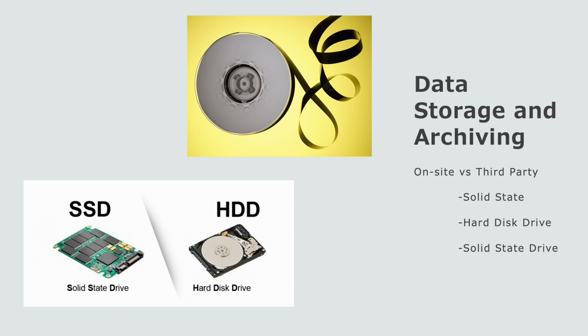Magnetic tape is really old, but it's steady, and regularly used. It's a regularly used way of storing data, believe it or not. The problem with magnetic tape is it's susceptible to weathering from friction from the tape against the metal reels. It's how it's read, and the celluloid covering can flake off. Magnetic tape is also pretty cheap and is only usually used with third-party data storers.